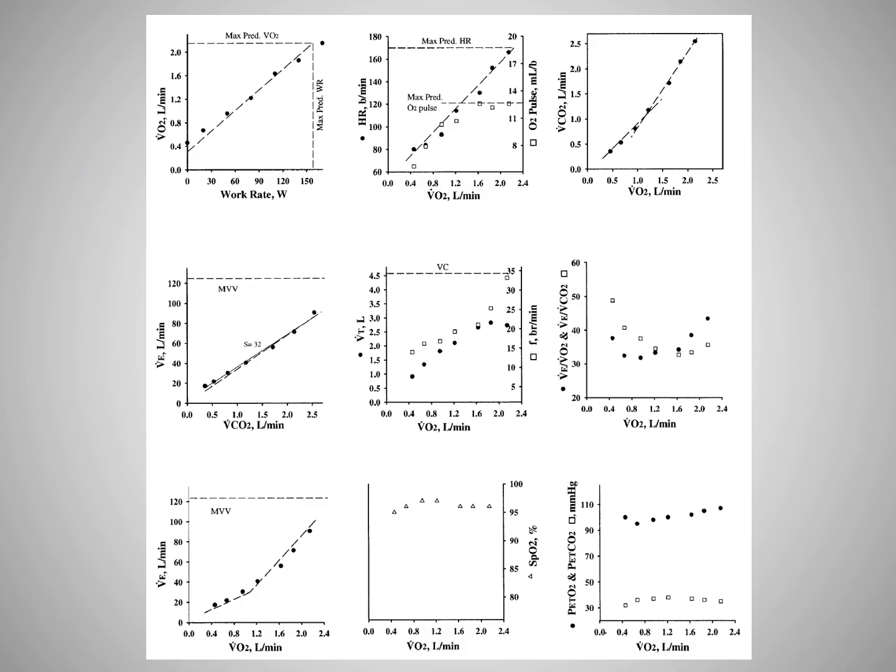Some authors recommend using a 9-plot page of graphs to interpret a number of specific variables during exercise, including for identifying anaerobic threshold. I'm not a particular fan of this method, since these postage stamp size images tend to be hard to interpret when examined individually.